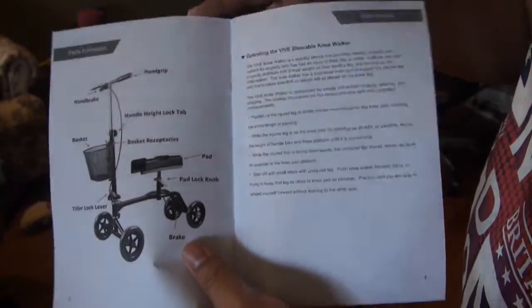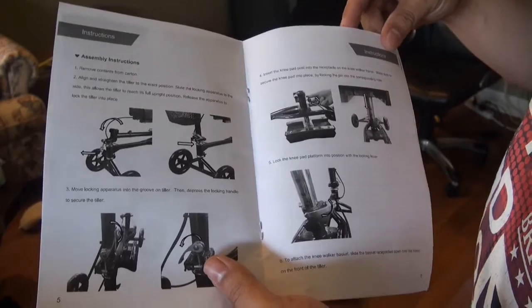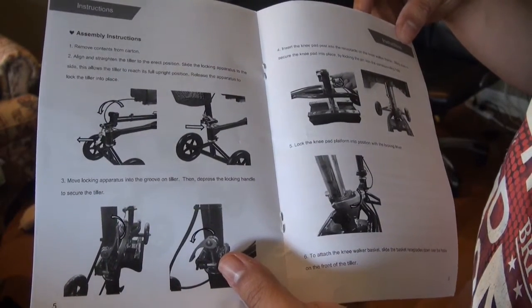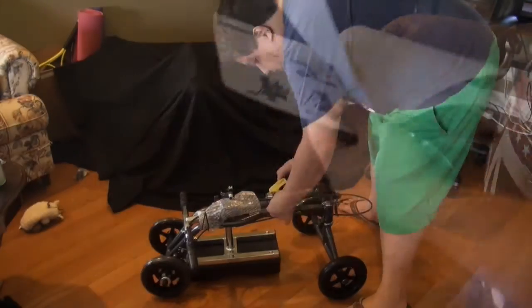The manual also has a graphic representation of the instructions on how to assemble the scooter. So let's do it — let's assemble this scooter now.